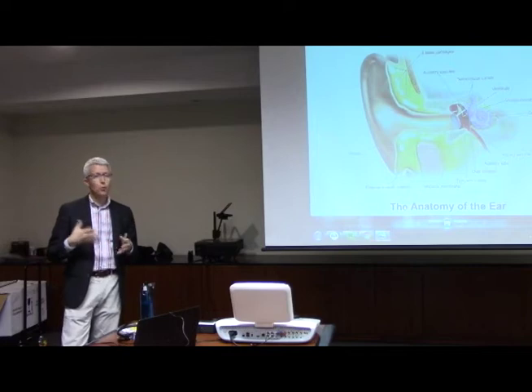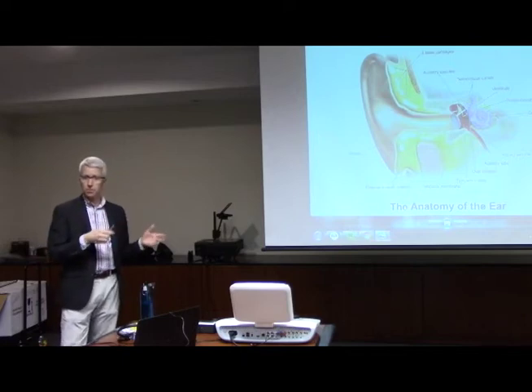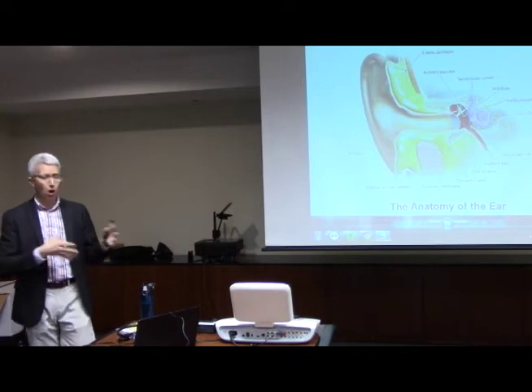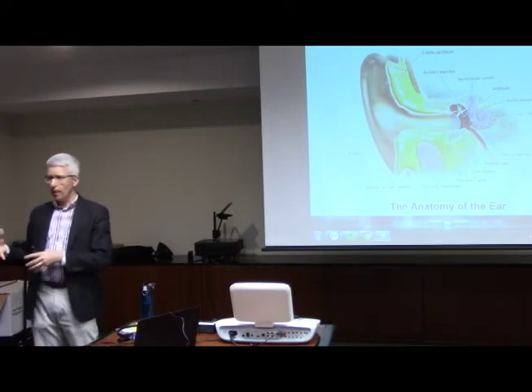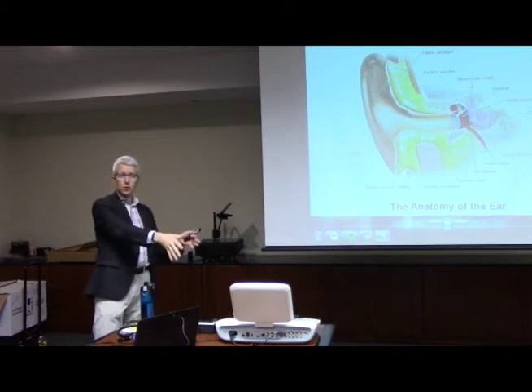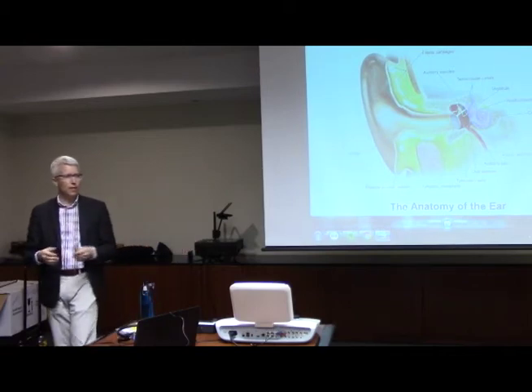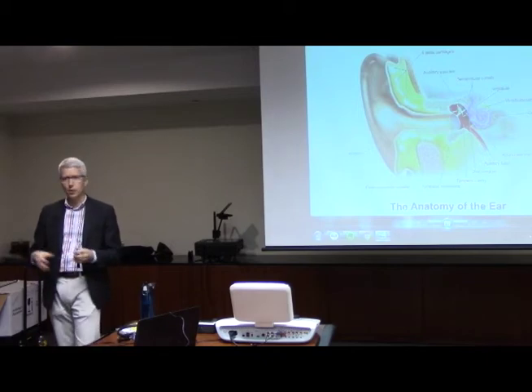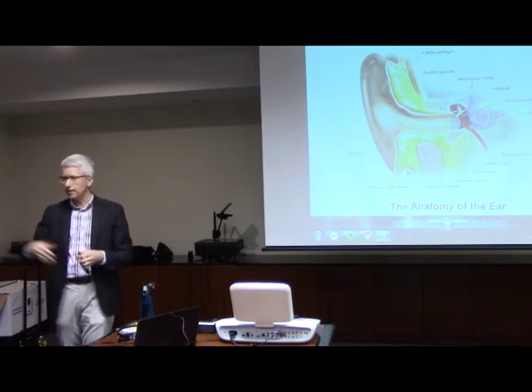And then there are some portables that have air, bone, and speech. So they either have the built-in or they have a microphone or both. But they're small, light, designed to be carried around. Usually they aren't quite as robust as this and what it can do, but it can at least get the job done well enough to go into a patient's home, or to take into another part of the clinic and do testing, that kind of thing.